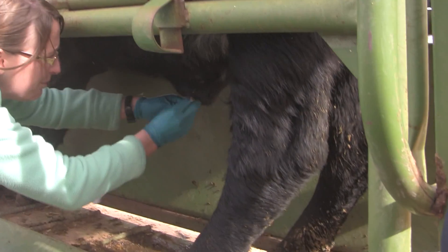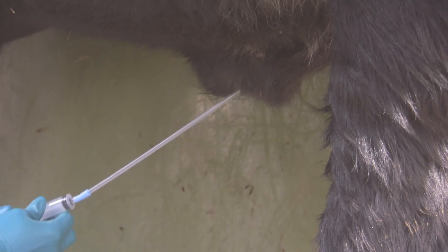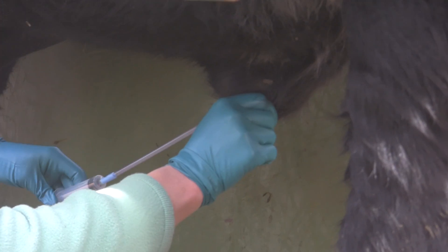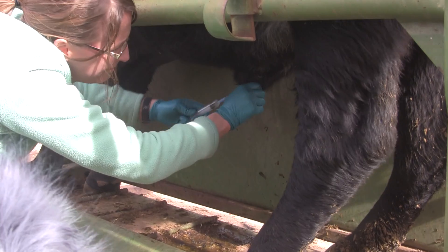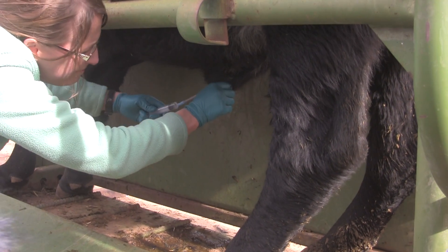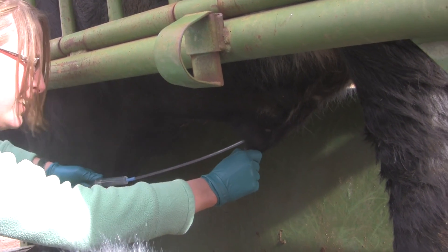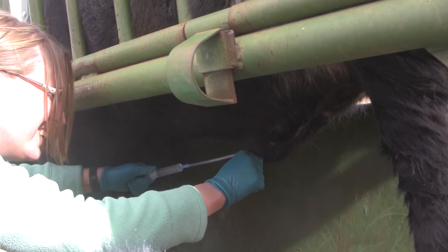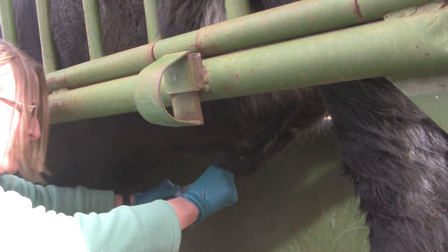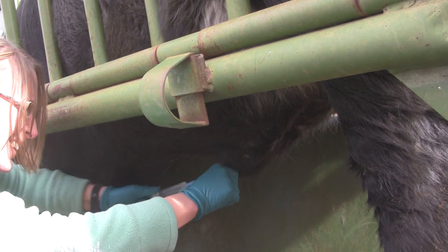What she's doing now is she's going to insert the pipette into the sheath. We've got a 12 ml syringe attached to the end of the pipette, which will allow for negative pressure. She's going to work the pipette up and down the sheath and to the sides. Within the sheath itself, as bulls mature, they develop crevices known as crypts. If the organism is present, generally you'll find it in the crypts. That's why you can't really treat bulls with trichomoniasis — if they have the organism, that's pretty much it. End of the road.